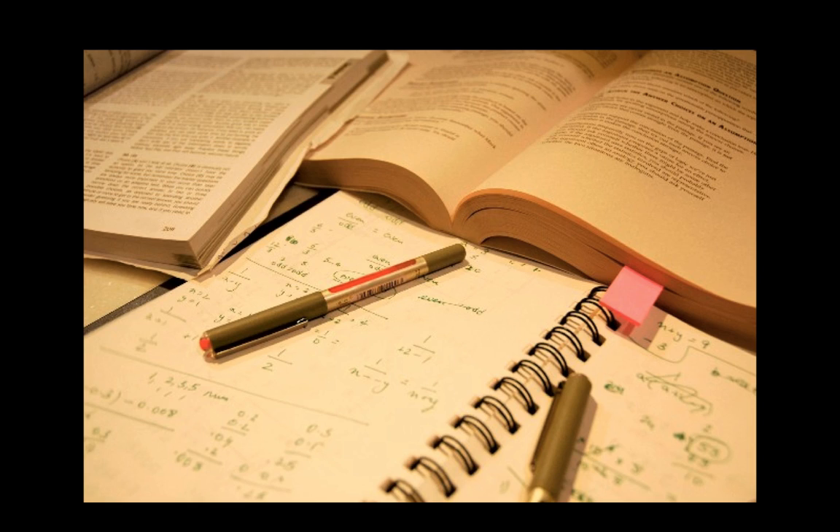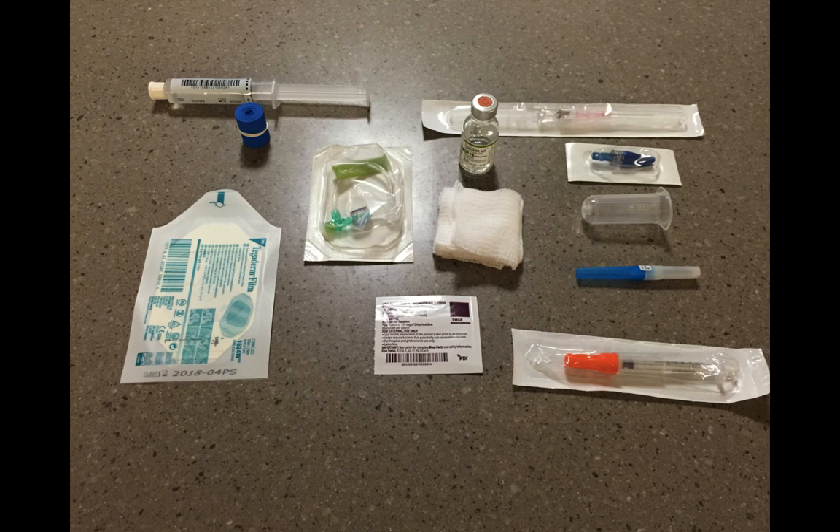Let's talk about the setup. It's all about preparation for this somewhat difficult and underused skill. Get all the necessary tools together beforehand — ask the nurses what they use and need. I grab a tegaderm, saline flush, tourniquet, some lidocaine with either a 29-gauge or 31-gauge insulin syringe, a very small single-use syringe, and supplies to draw blood work. I also get my angiocath, the blue luer lock auto-stop adapter for the IV connector tubing, and a way to cleanse the skin.